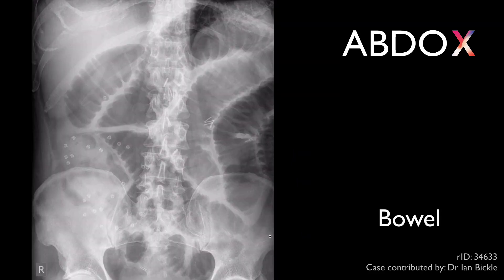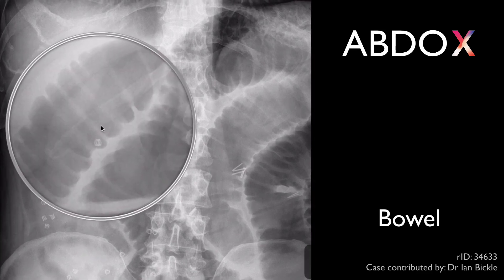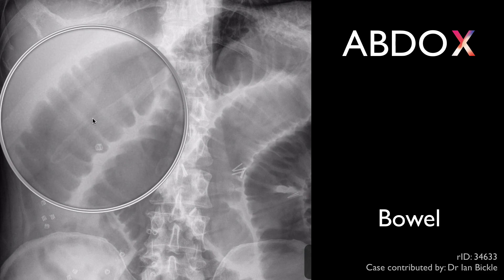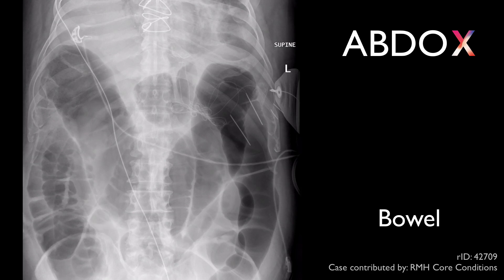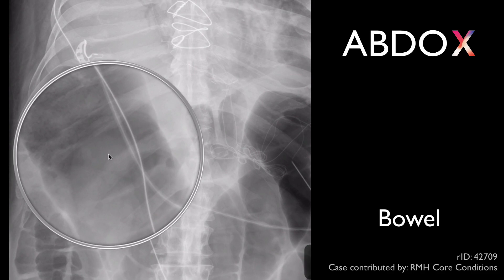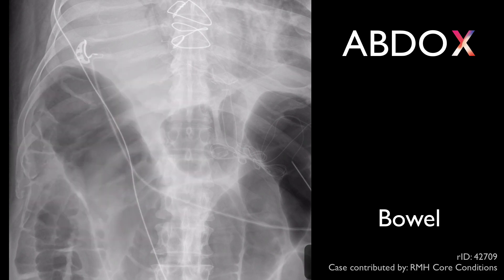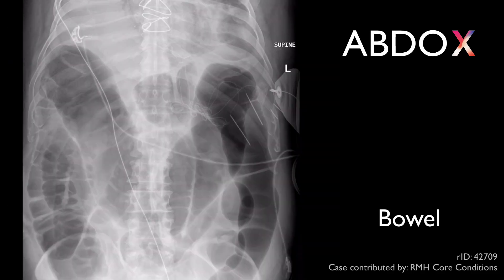B is for bowel. Small bowel can be identified by its central position and lines running all the way across the diameter of the lumen, known as the valvulae conniventes. In contrast, large bowel usually lies peripherally, has lines running part of the way across the diameter, known as the haustrae, and usually contains mottled fecal matter inside the lumen.